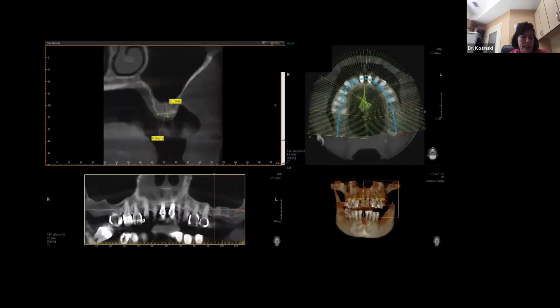The CBCT analysis is a very useful tool to visualize more accurately the amount of available bone. The sagittal view demonstrated here clearly illustrates that we can actually have about 6.7 millimeters of bone height from the crest of the ridge to the floor of the sinus, and 8 millimeters of available width of bone. Understanding our ability to tent the sinus floor, we can lift the sinus 3 millimeters predictably without perforating the Schneiderian membrane. This is a simple and predictable method of placing the proper width and length of a dental implant.